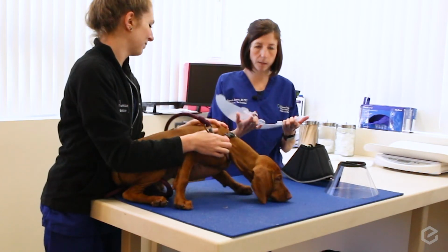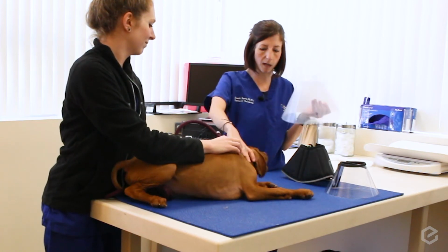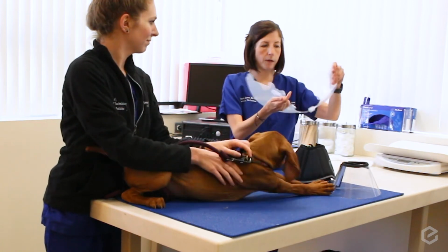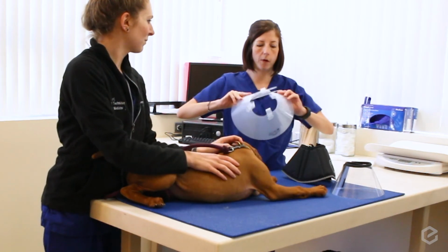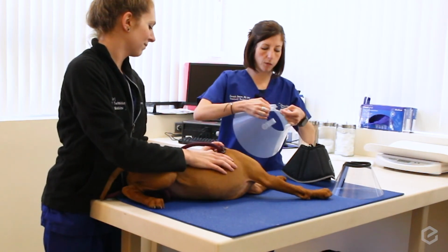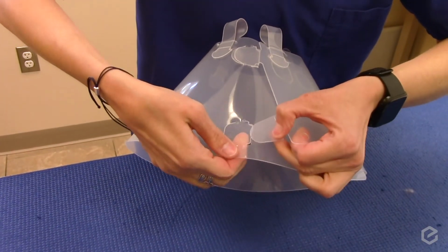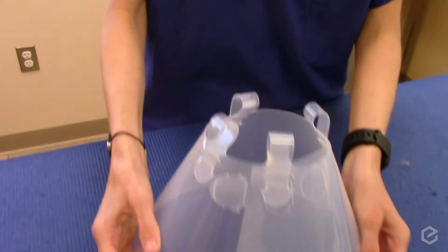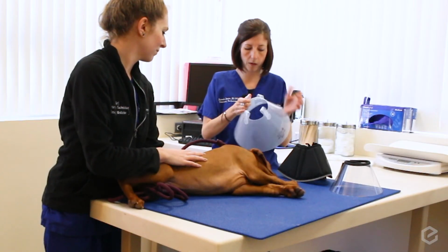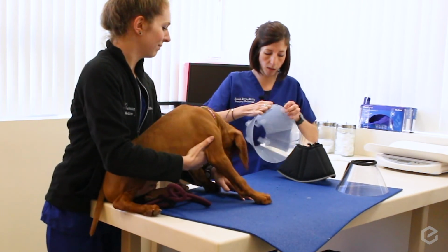And so now we need to make sure that we fasten it to a size that's going to fit appropriately. So he's got a pretty small neck, and there are 3 different options for sizing that you can go to. So I'm going to go to the farthest one. And again, you go in through the top and out through the bottom. And this will just click into place and it'll be fastened together. So now this collar is ready to be placed onto the patient.